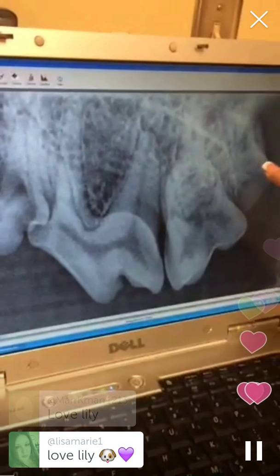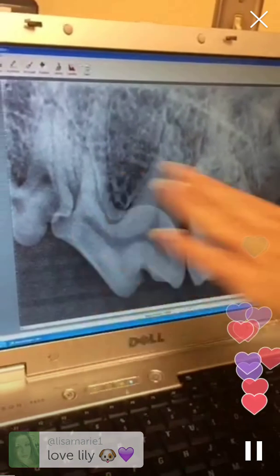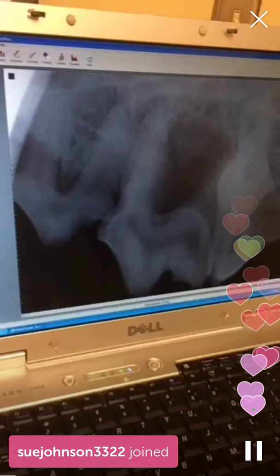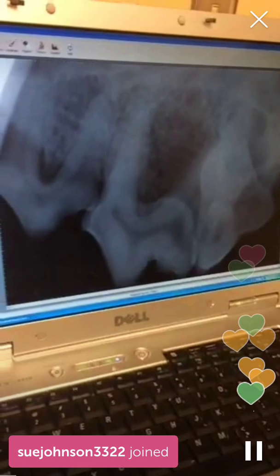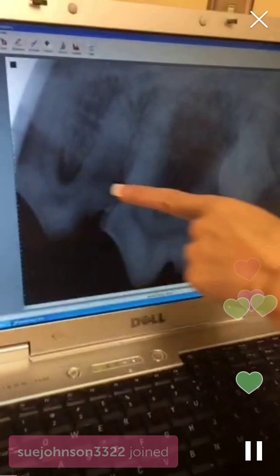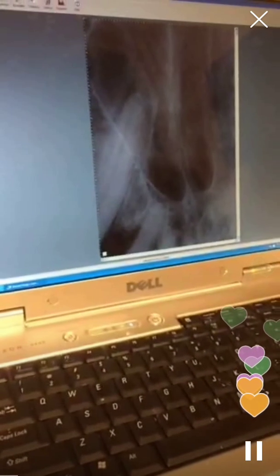This is the last molar, this is the 4th premolar, and this is the 1st and 2nd molar here, and everything looks normal. So we didn't have to do any extractions on this side of the mouth. That was the upper left side. Everything looks fantastic here. We want to see nice thin lines around the periodontal ligament. We want to see no bone loss here. Everything looks great. Now, not so much for the right side.